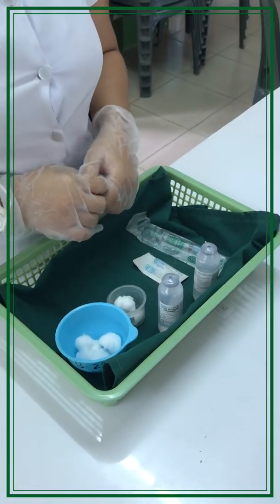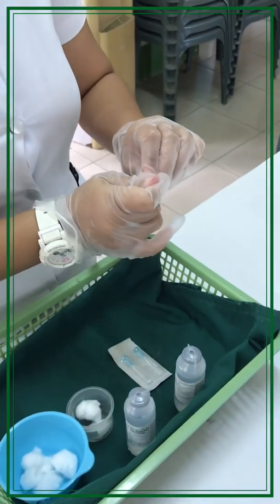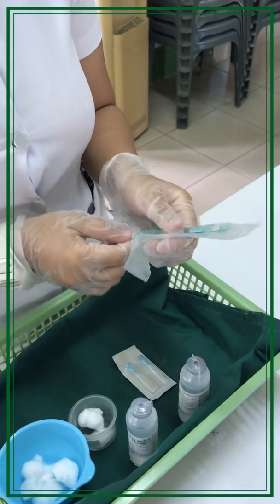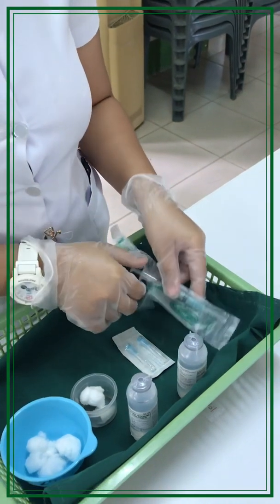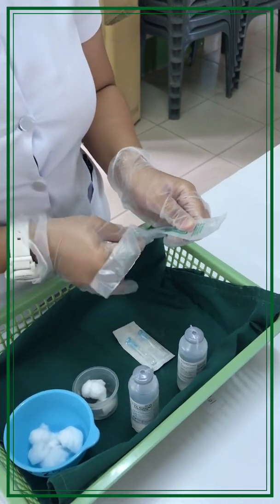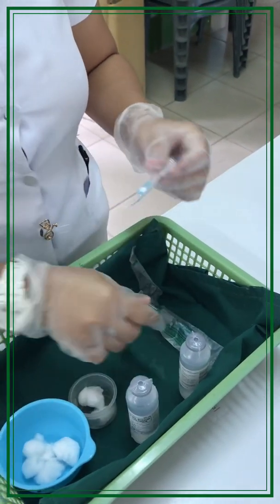In preparing the medication, we need to aspirate the air from the syringe in order to avoid complications like air embolism. Replace your injection needle with your withdrawing needle.